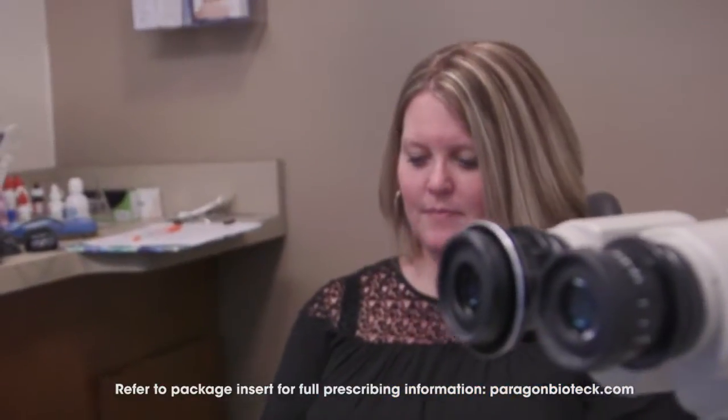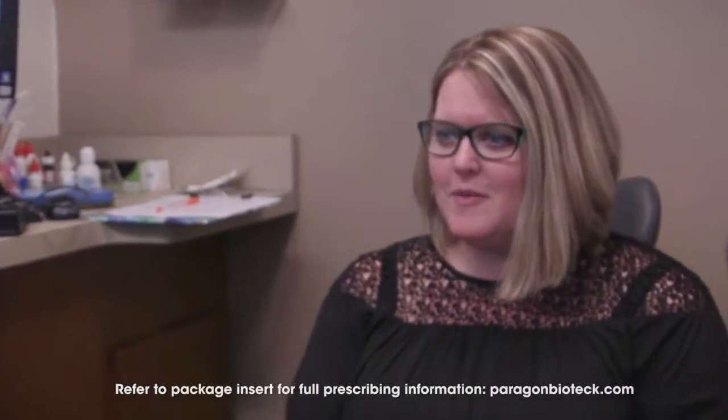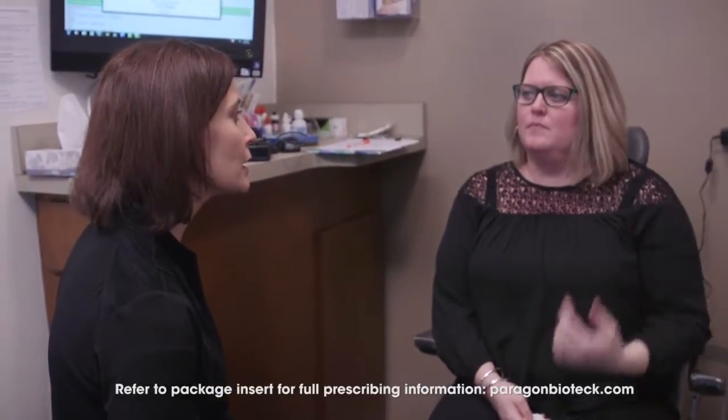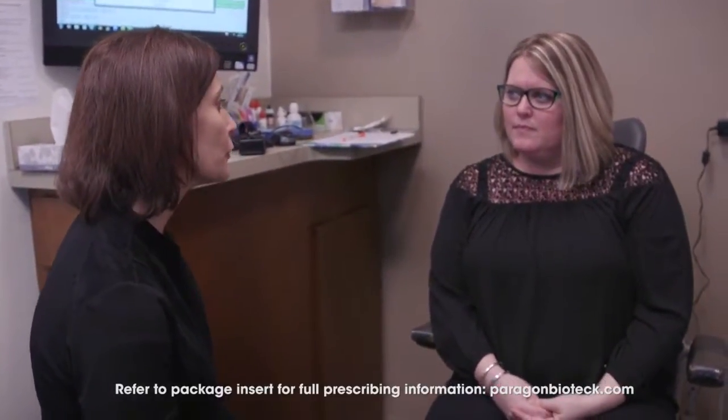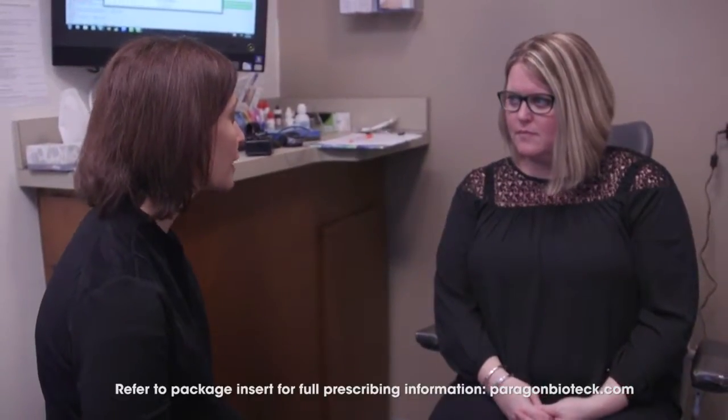After insertion is complete, give the patient a few moments to adjust to ensure that he or she is comfortable. Before sending them on their way, be sure to ask how their eyes are feeling. The patient should experience no discomfort with Lacrizov 180-Absorbable Punctum Plugs — it shouldn't even feel like they're there.